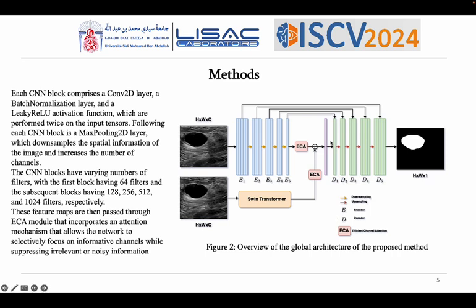After we have our bottleneck layer here, we are going to use a decoder to construct the final output of our architecture, which is the segmentation mask, and we are going to use the same blocks as the encoder, but this time with the upsampling operation rather than the downsampling operation, so that we reconstruct the segmentation mask.